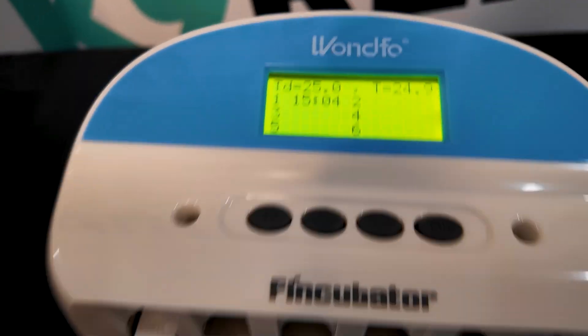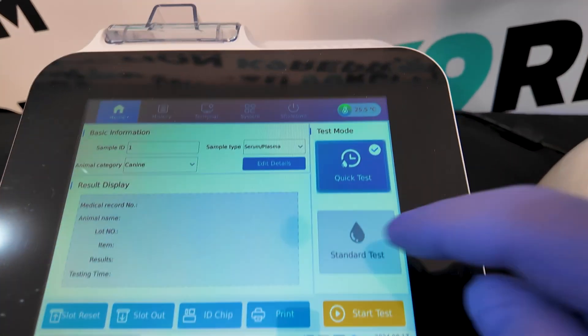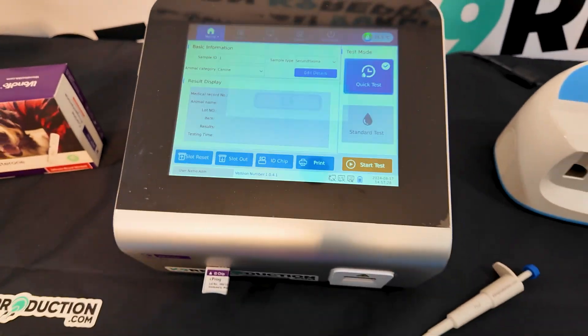After the 15-minute incubation, remove the test strip and insert it into the Wanfo Pro-DX machine. Select Quick Test Mode for immediate results. The machine will now process the test strip and provide the progesterone reading.